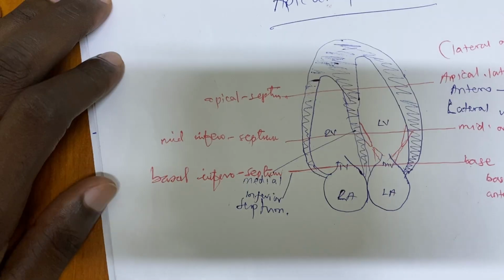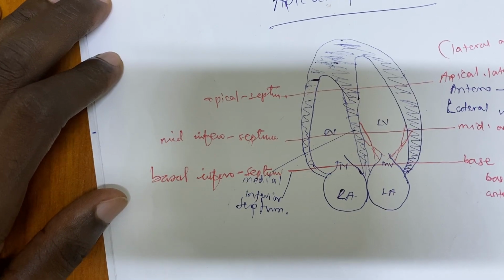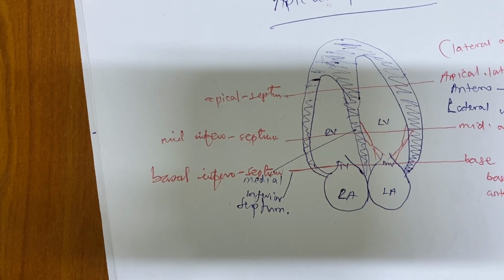So this is how it is. Whenever you see equals being done, and then you see these ones, practice is supposed to be how to name the walls, how the walls are named. You identify them. This is anterolateral, inferolateral. This is anterior septum, inferoposterior, or inferolateral.